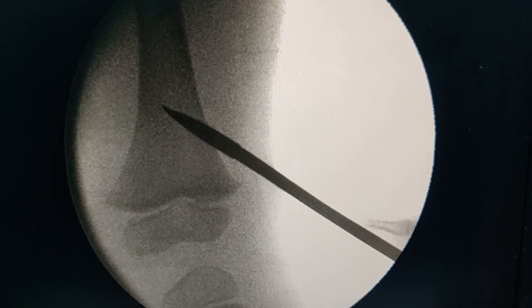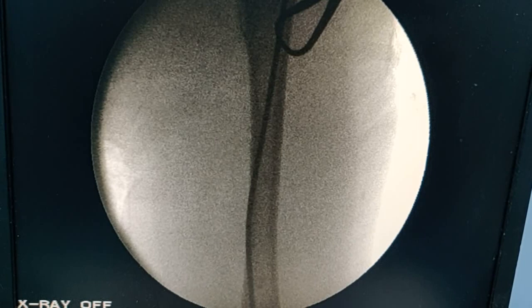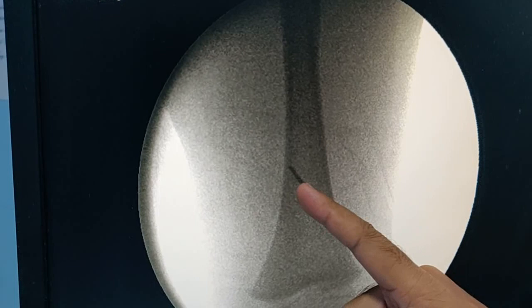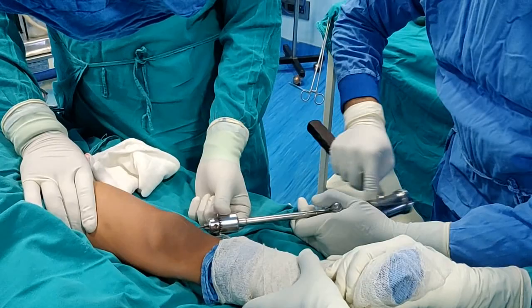We started at 90 degrees, dropped our hand, and have made a good hole. The next step is to pass the nail. There is controversy about whether to pre-bend the nail or put it straight and let it follow the bone contour — I usually pre-bend the nail at the fracture site before passing it. Now the nail is inside. This is one difficult point: the nail has to travel up past the fracture. Just be patient, rotate your hand or use a mallet and tap it gently, and you will find it goes in the right direction.